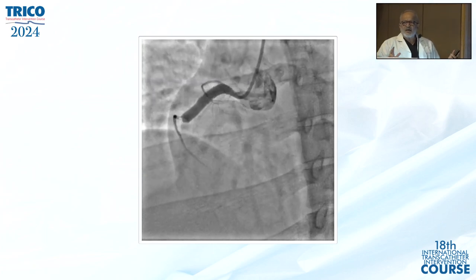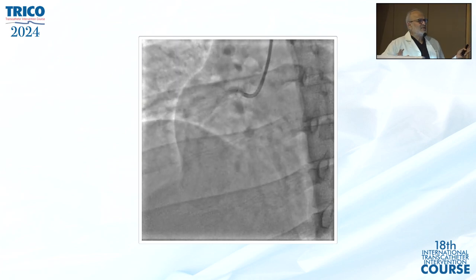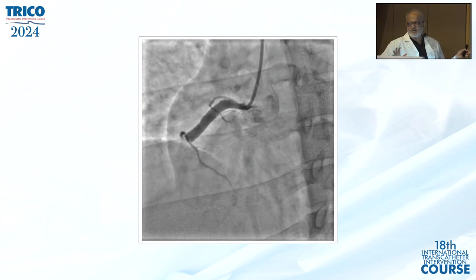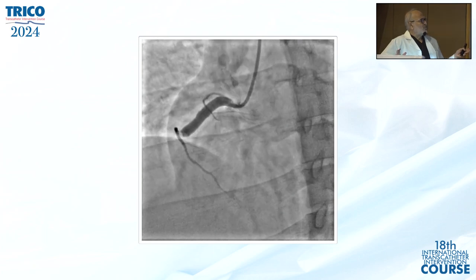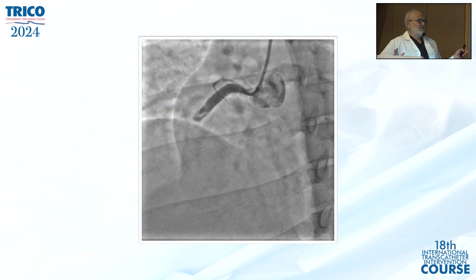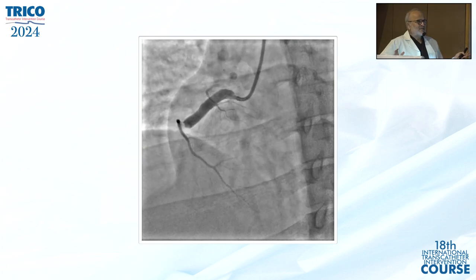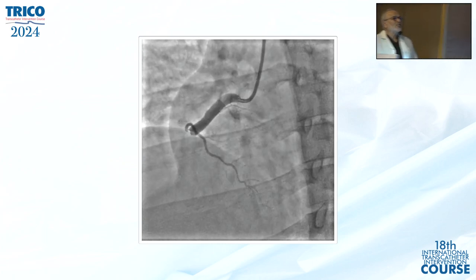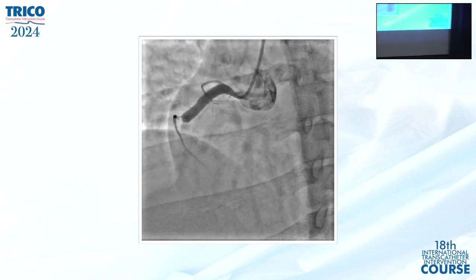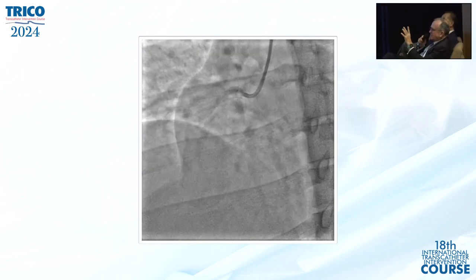Number one, will you like to keep the patient conservatively on heparin and leave the patient alone? Number two, will you like to do thrombosuction although it is class 3? Or number three, what do you think? Or no clue? I think the first thing you have to do is get a wire across. Sometimes there's less thrombus than you might think.